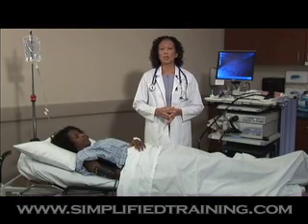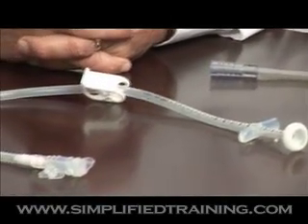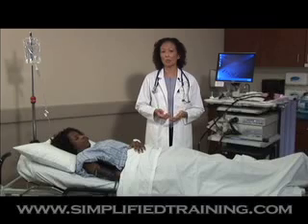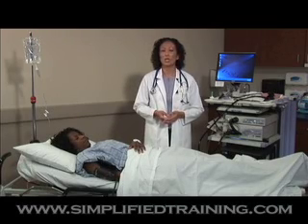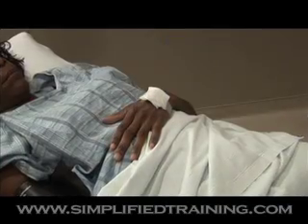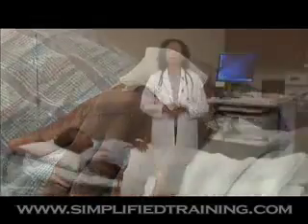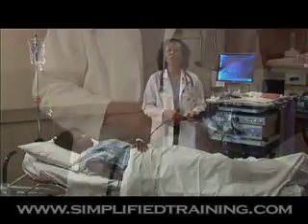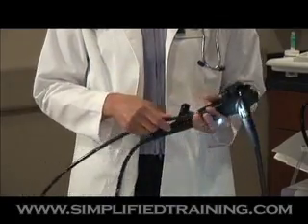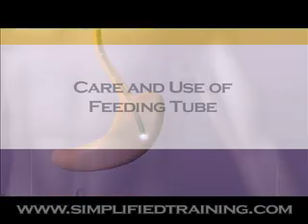This section explains step by step the procedure for inserting a PEG tube. The placement of the PEG tube is usually done by a gastroenterologist working with a surgeon and takes about 20 minutes. First, an IV, an intravenous tube, is inserted in your hand to give you medication to relax you into a light sleep and help control any discomfort. The room is darkened and an instrument known as an endoscope, a thin, long, flexible fiber optic tube with a microscopic camera on its end or tip, is inserted through your mouth downward into your stomach.